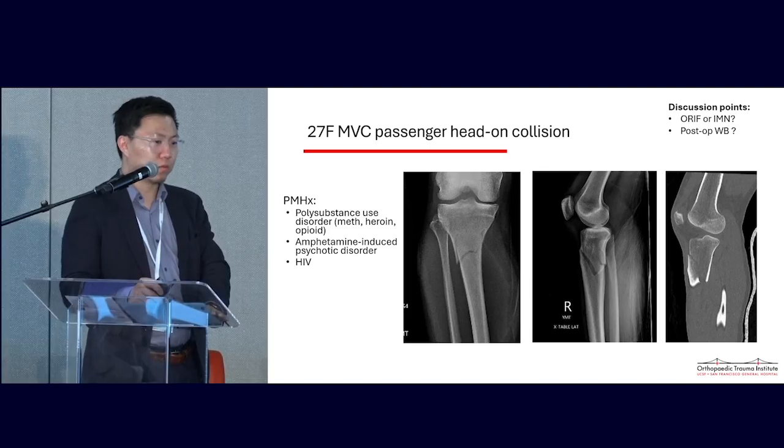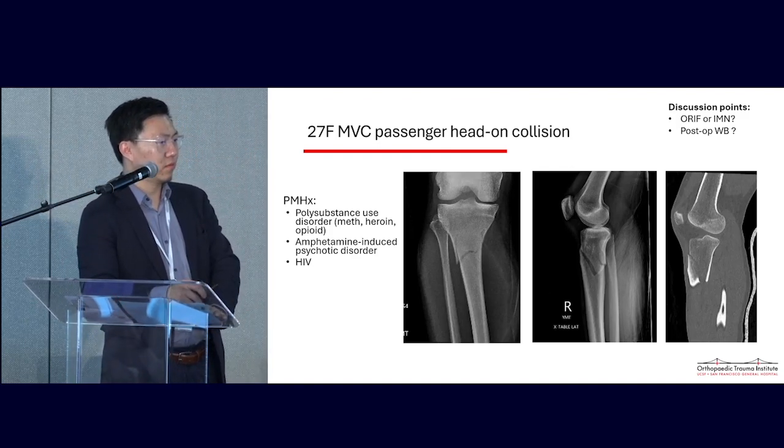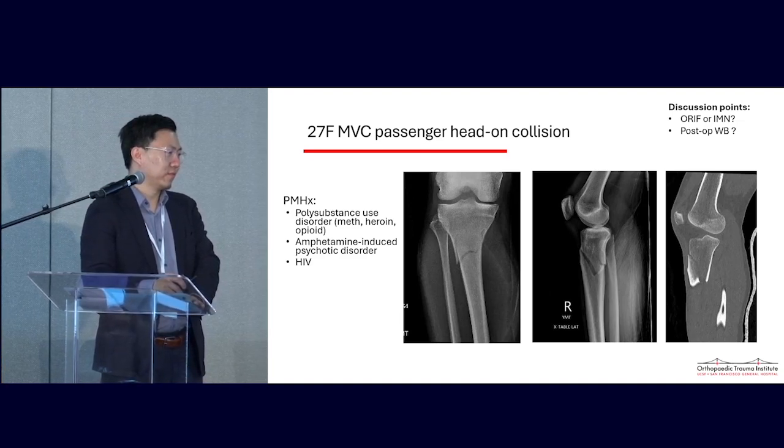Kyle, when you just look at those initial films, what are you thinking? What's going to match this patient's overall stature? It's funny because you were reading my mind. I was thinking the easiest thing to do is put a plate on. It's pretty much reduced, and I can put the plate on.